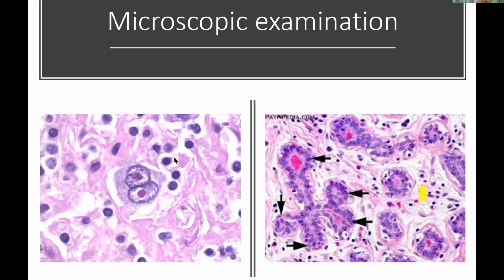You can see this is a lymphocyte. Okay, this is again a lymphocyte. And this one, okay, this is sections from the breast tissue.